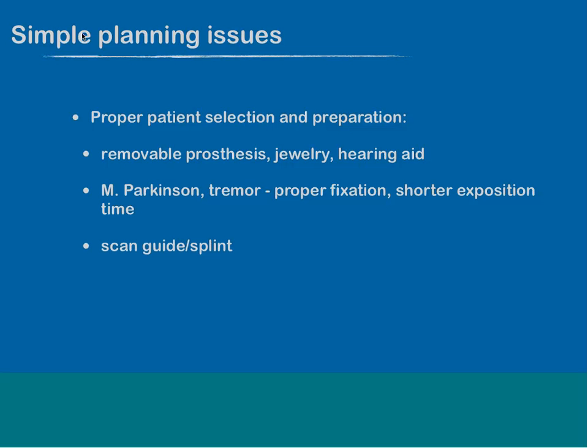And please, in every case where you want to do implant planning, use a scan guide or a scan splint. Even if you don't want to make navigated implants or computer-aided implant positioning, just use very, very easy scan guides with some cylindric reference objects or something like that. I will show you in a minute.